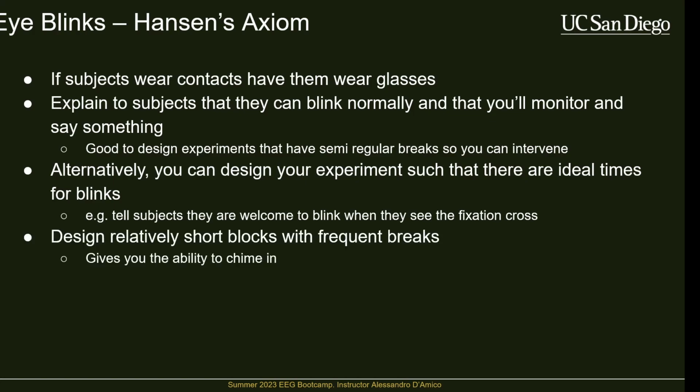Short blocks with frequent breaks. It also gives you the ability to chime in, so you can check in on the subject. If you see someone's getting drowsy or something, you can offer them some water or whatever, talk to them for a little bit to wake them up. So breaks have other benefits.